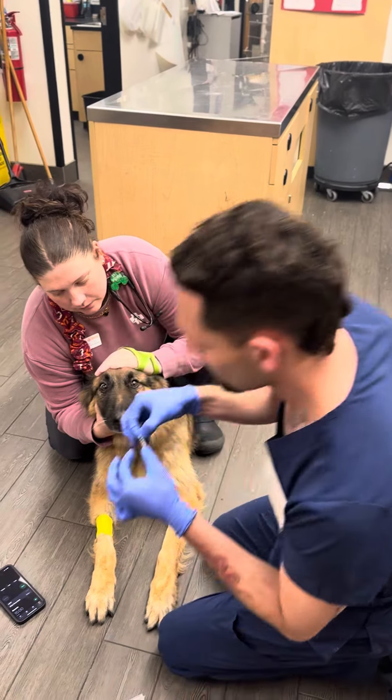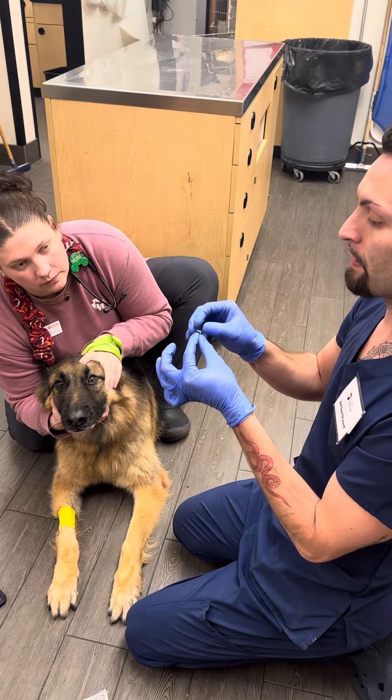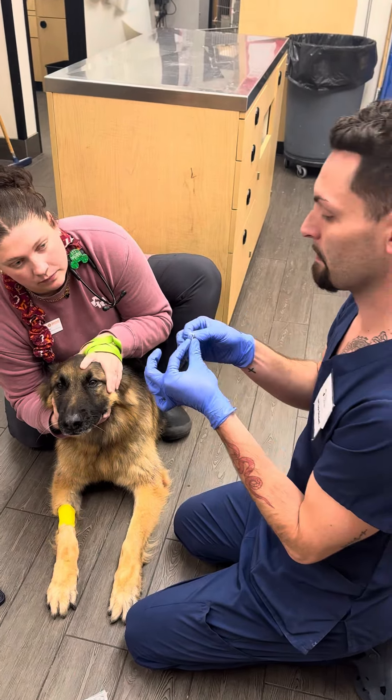I'll be performing a Schirmer tear test on the K9, so I will leave my timer on for one minute once I place the strip in.